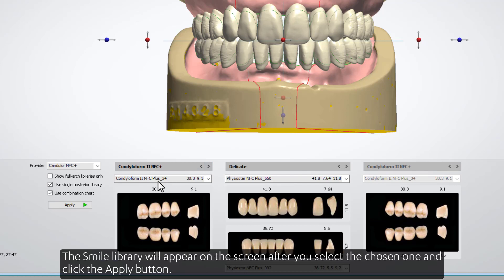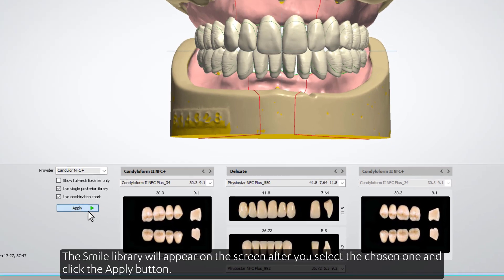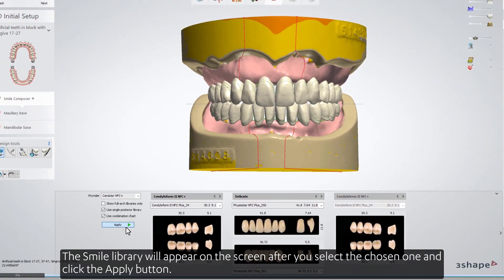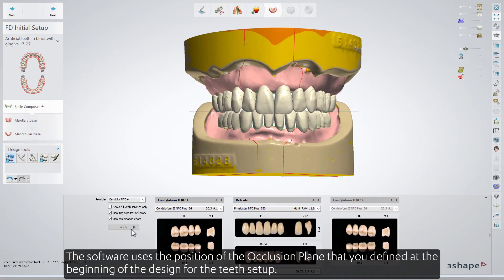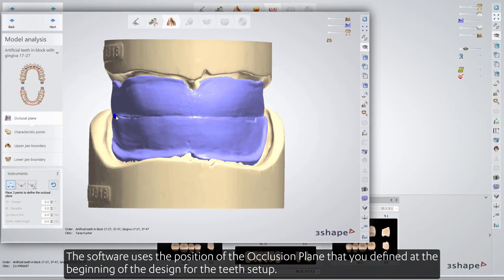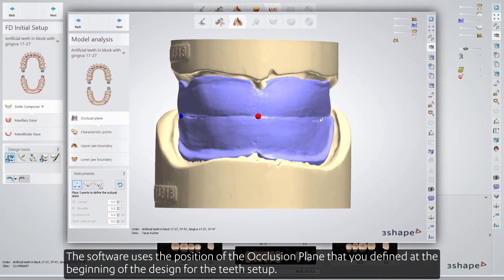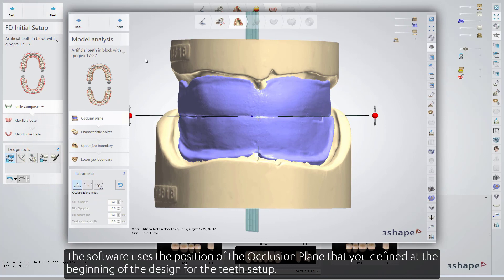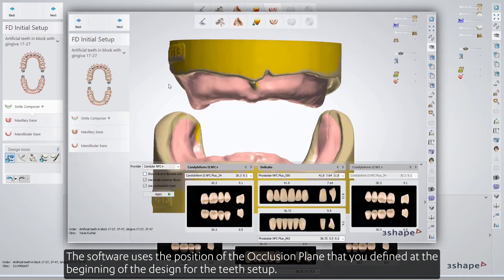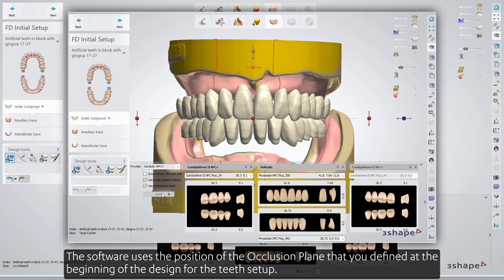The Smile Library will appear on screen after you select the chosen one and click the Apply button. The software uses the position of the occlusion plane that you defined at the beginning of the design for the teeth setup.